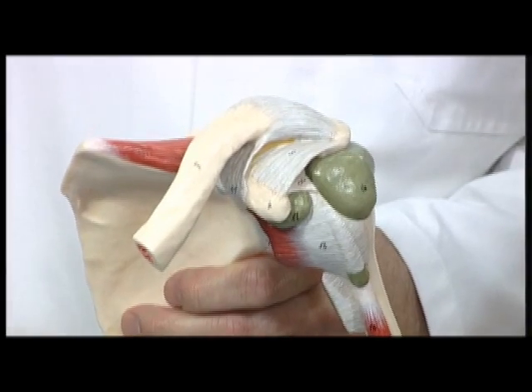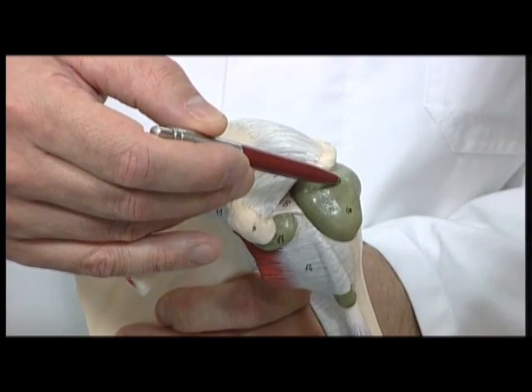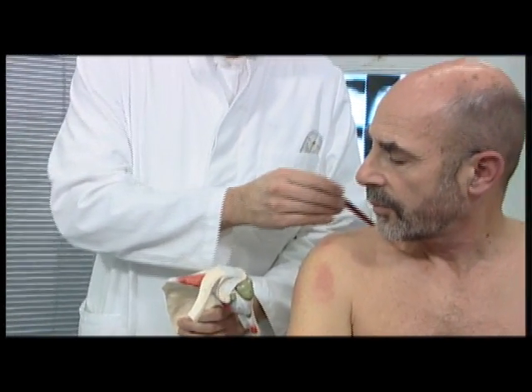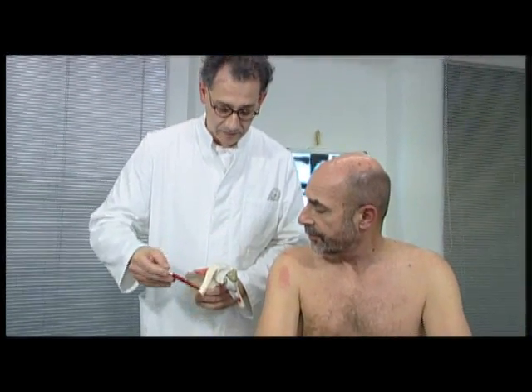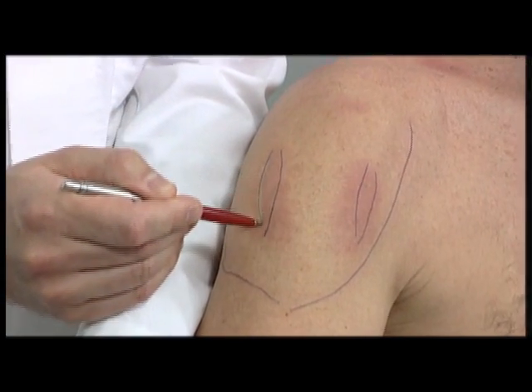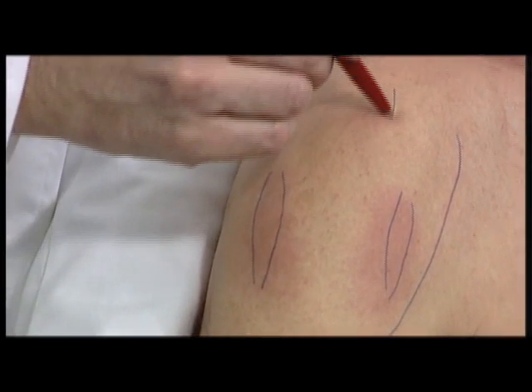Herr Berger, die für Sie schmerzhafte Stelle ist. A model is used to show the patient where the pain mainly originates, in this case at the tendon insertion below the bursa. Den habe ich hier oben durch Druck auslösen können. Ah, ja. Hier vorne ist das Schlüsselbein und da das Schultereckgelenk. So, ich zeichne jetzt den. The doctor marks the affected deltoid muscle and the trigger points to give the patient a better idea of the pain region.